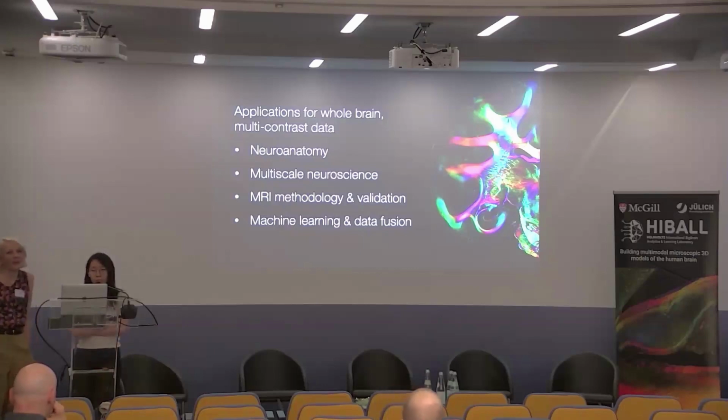So it depends a bit on how you create the layers, right? Whether you want equivalent volume or equivalent distance across the layers. When you get the layers from FreeSurfer, I wouldn't argue they're anatomically faithful layers, but they are a set of coordinates between which we can compare the MRI and the microscopy really nicely, across the brain. So I would love someone to take this data and the histology and do proper layers. That would be really cool. So did you choose between equivolume or equidistance? I can't remember which one I've used here, but I have both of them.